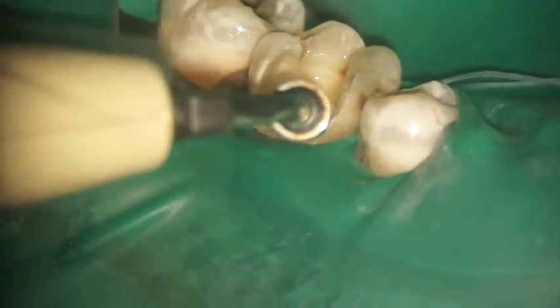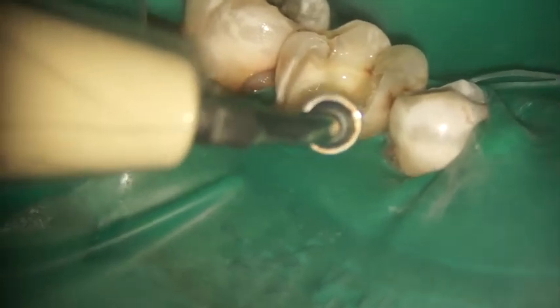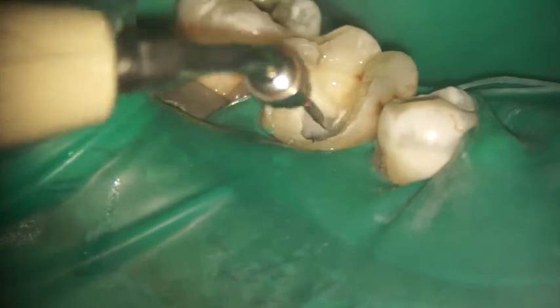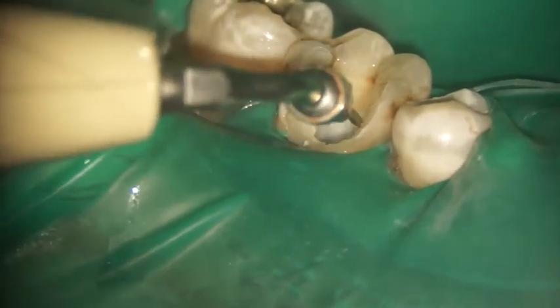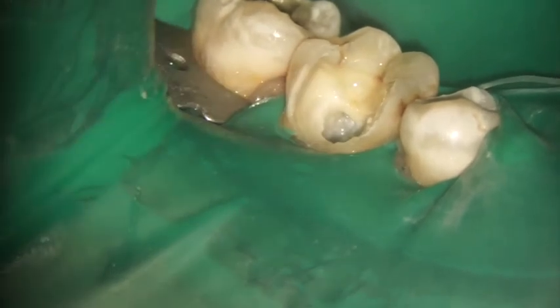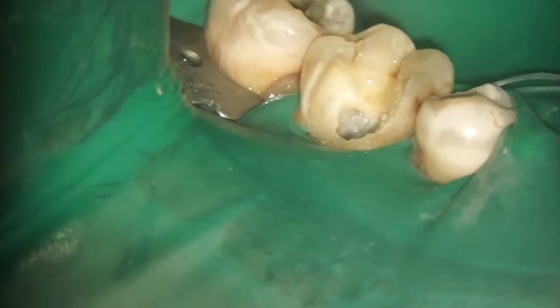We shall modify the U file according to the cavity design. For every cavity, we may need a separate design of the U file. In whichever way the operator is convenient, the U files can be bent and used accordingly. So this could be a good tip for the cleaning of pulp horns and any other constricted areas in terms of constricted access or truss access.